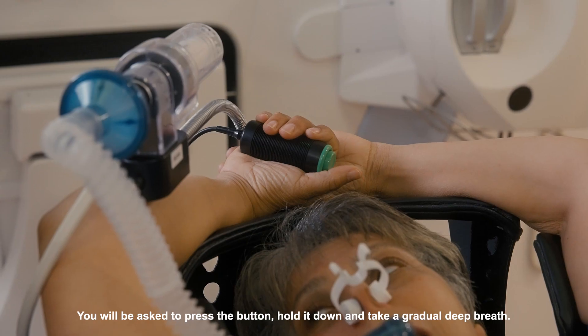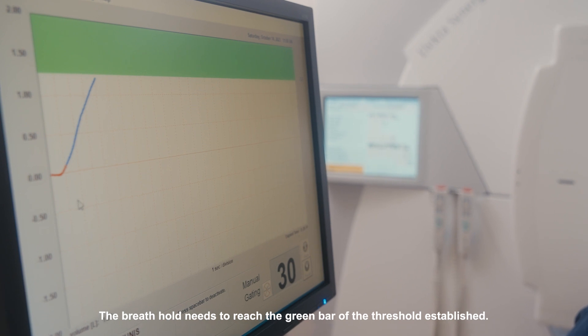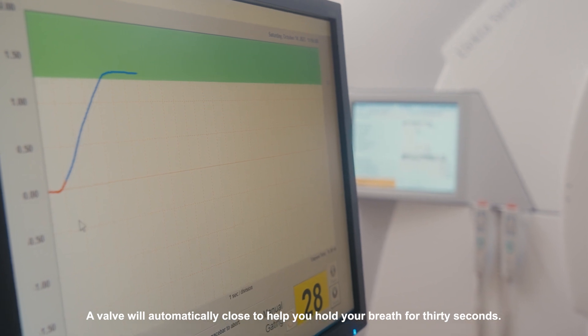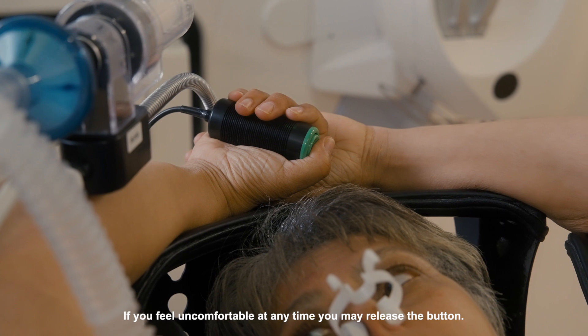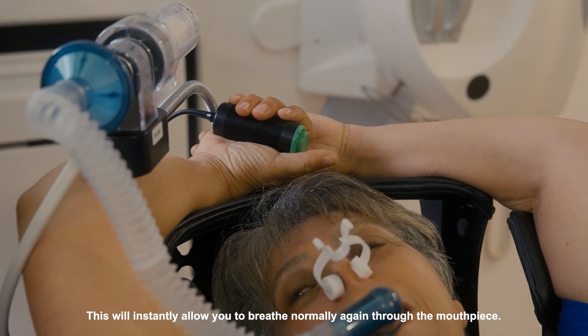You will be asked to press the button, hold it down and take a gradual deep breath. The breath hold needs to reach the green bar of the threshold established. A valve will automatically close to help you hold your breath for 30 seconds. If you feel uncomfortable at any time you may release the button, which will instantly allow you to breathe normally again through the mouthpiece.